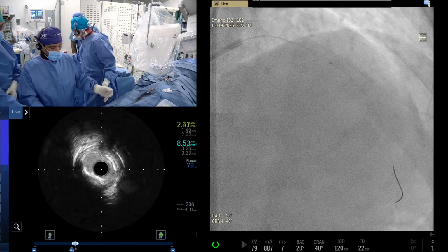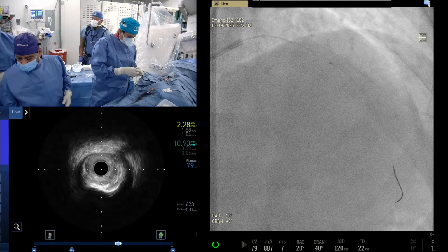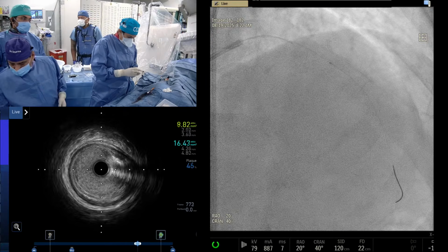Okay. All right. So the change in diagonal, stent. The diagonal may end up being a bigger vessel than what it looks.